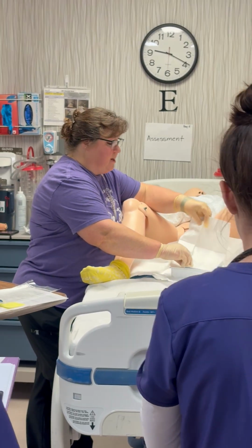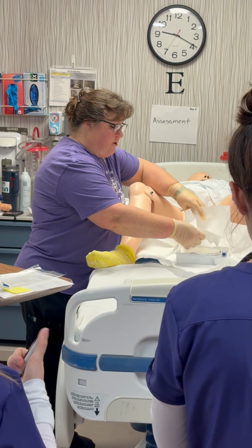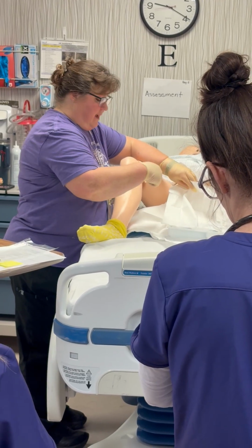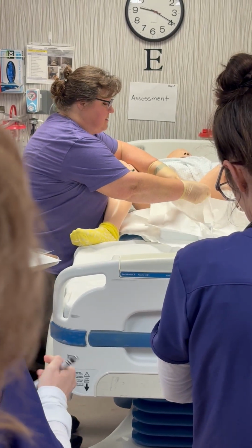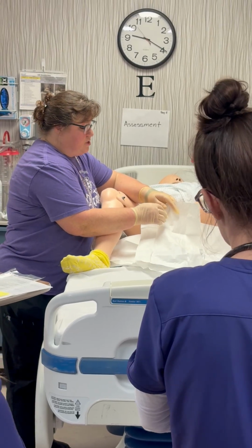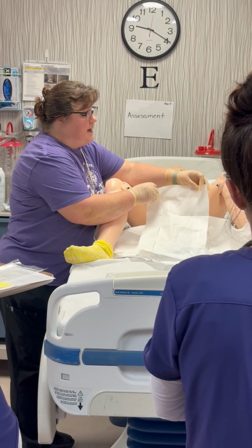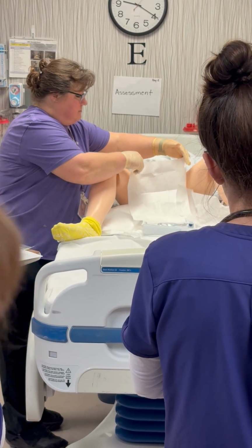Pad. This pad goes on first, and it goes shiny side down. Make sure that you're being careful that this doesn't go outside, or many times what happens is you're not paying close attention and it touches the leg, okay? So you need to make sure that you open this appropriately. All right, so one thing that you need to make sure of, shiny side down, so you have to be careful, right? Shiny side down, and I am backing this in like this, okay?